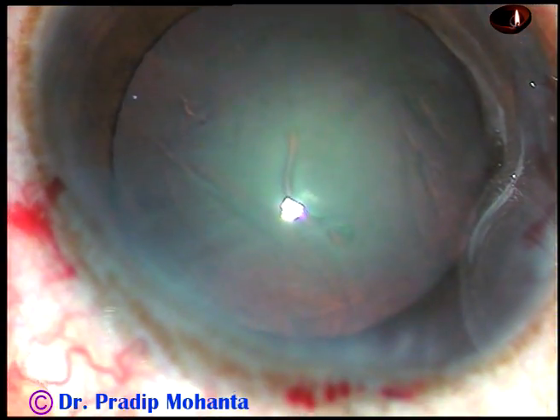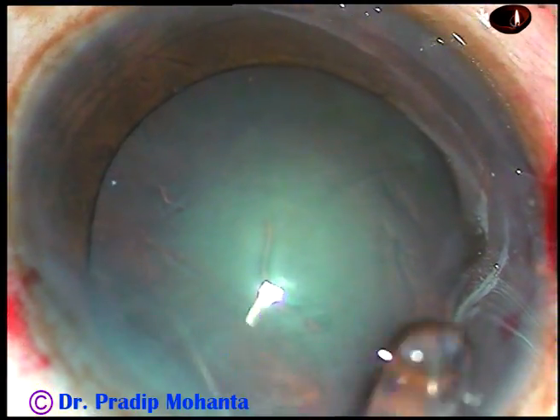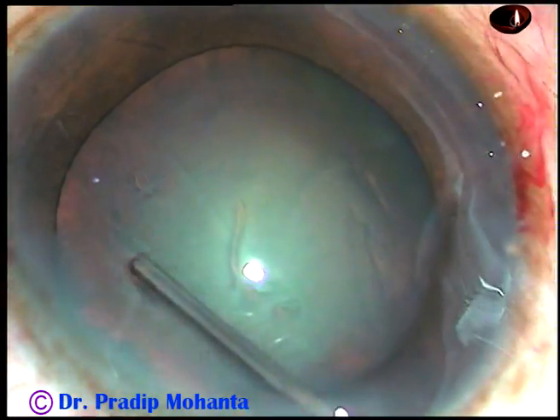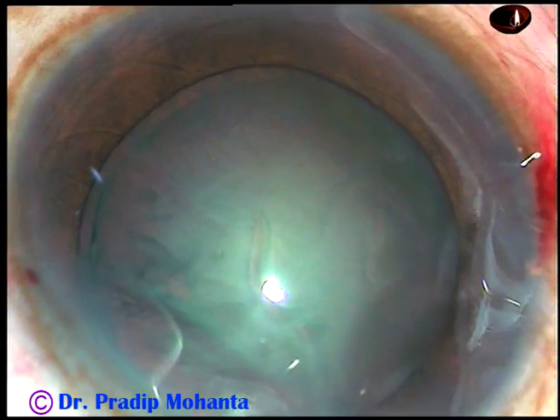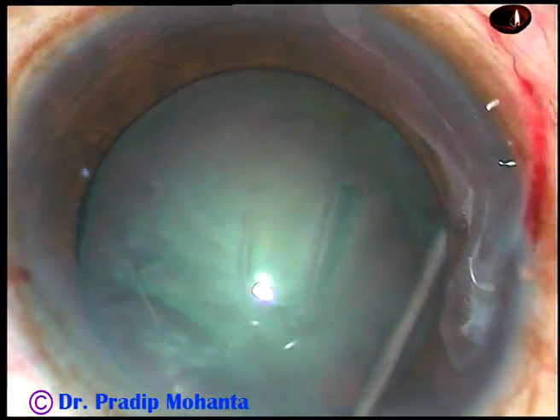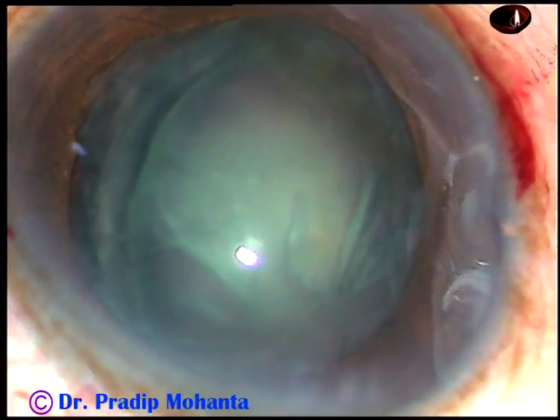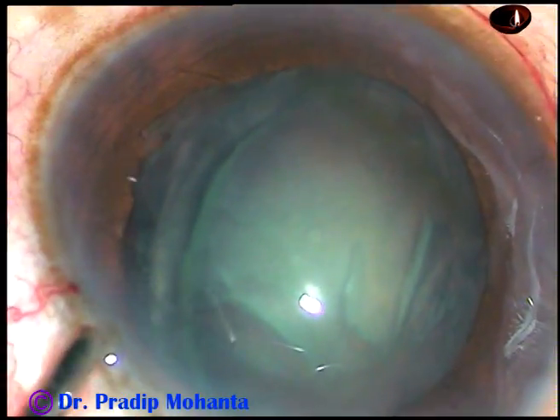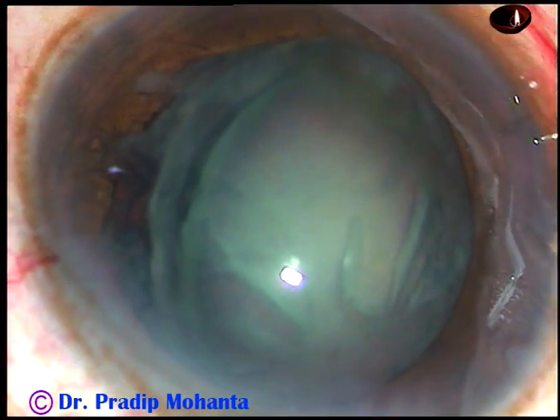Friends, this is a totally unedited surgery — real-time surgery. Now hydrodissection. Fluid wave is passed. Hydrodelineation is also attempted. Now as I do hydrodissection on the opposite side, see what has happened: the equator on the left side has come out of the bag and it is in the supracapsular space now.